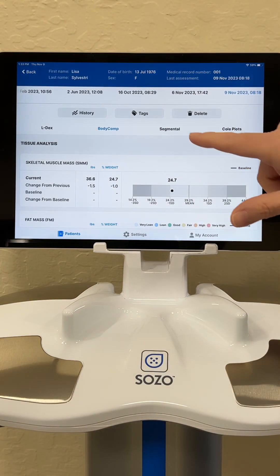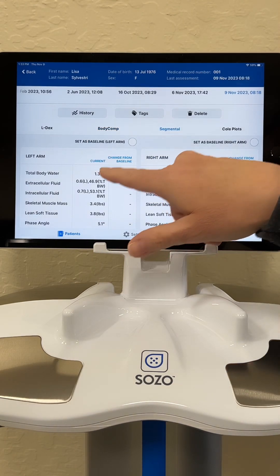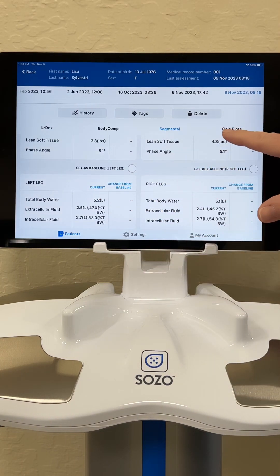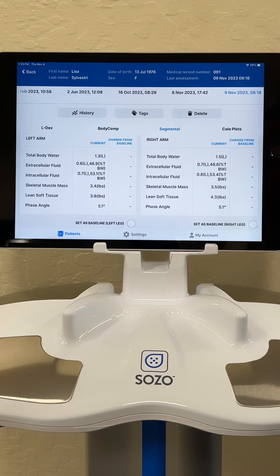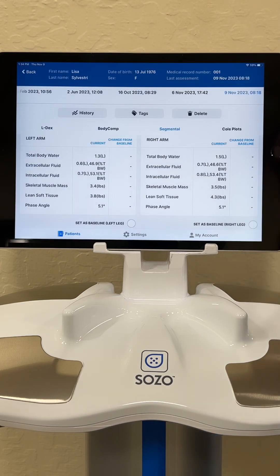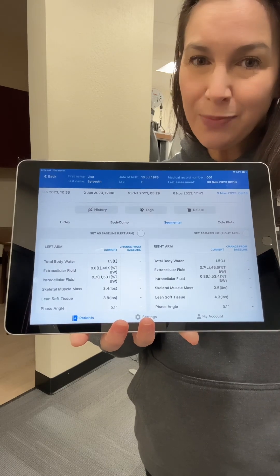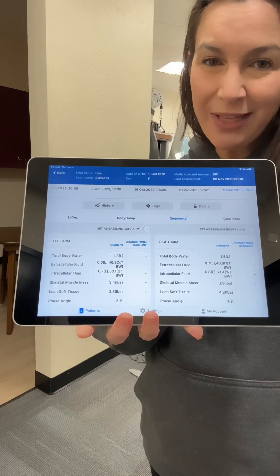The last thing I'm going to show you is that we can break down these numbers even further and look at segments by themselves — the left arm versus the right arm, and the left leg versus the right leg. This is always nice to see when we're comparing our normal or unaffected side with our affected side. This is what we like to look at when using our Sozo machine for LDEX scores for lymphedema. I love having this device here at our office, and I hope this has been helpful and helps you understand the different things we can look at here at Oasis PT and Wellness to help you in your recovery and treatment.